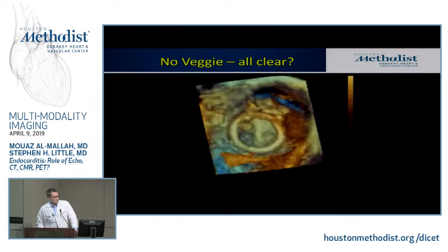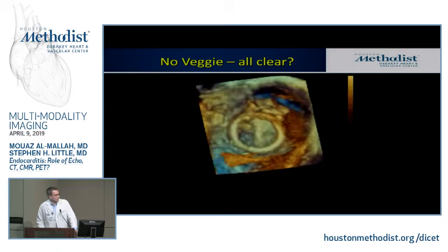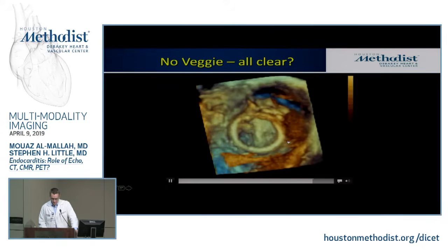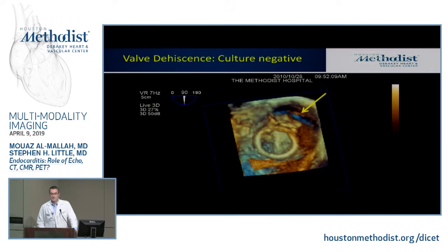This is a different one. This was a physician referred to us. He'd had a history several years ago, 2 years ago actually, of basically a total crux rebuild in Philadelphia for endocarditis. And he was visiting Houston and collapsed, and the TEE shows the mechanical mitral valve, there's a little bit of suspicious thickening around here, but no obvious vegetations. And this over here is often written off as the aorta, but it wasn't the aorta. That was a massive dehiscence from basically a quarter of the circumference out to the crux. So that was not survivable.